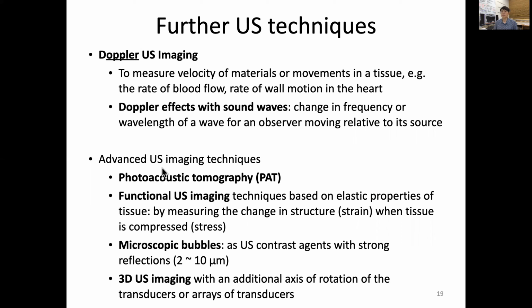Another very interesting advanced ultrasonic imaging technique, which I'm not going to discuss right now, is photoacoustic tomography. As the name implies, photons generate an acoustic source, and we can image it with ultrasound to create a tomographic image. This is called PAT, an emerging technology that allows more functional imaging by combining the use of photons and detection with ultrasound or sound waves.